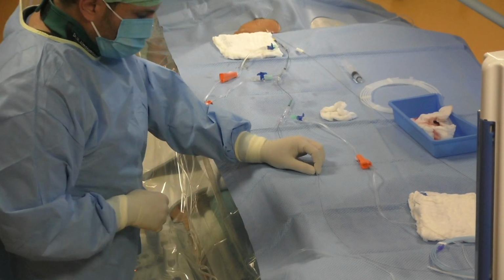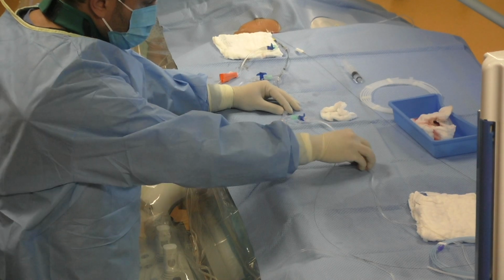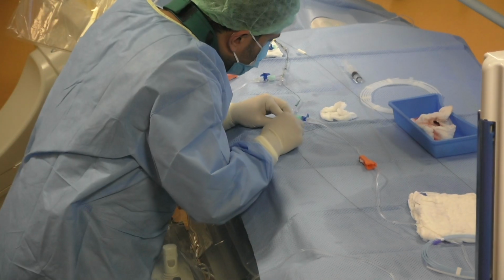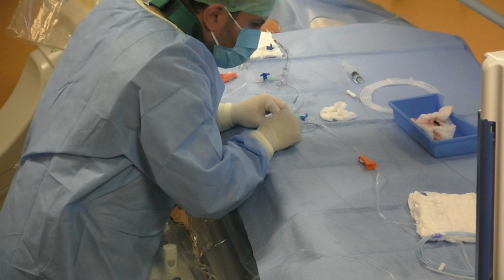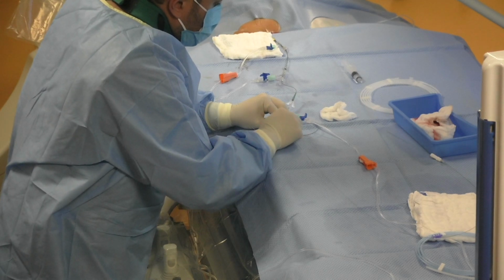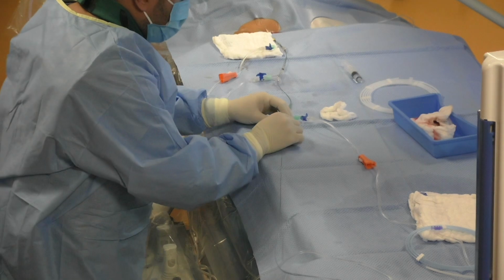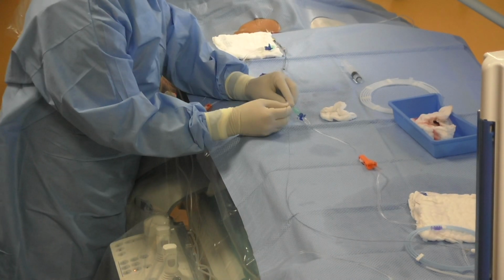And if you work alone, you can make a loop with the insertion sheath of the flow diverter, just like that, and you can push the flow diverter through the loop while you're holding both ends of the insertion sheath. And now we pull the insertion sheath a little bit back, and we can work with the pusher of the flow diverter.